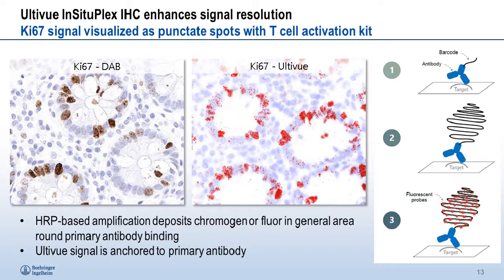And this threw me off at first, when we're looking at the Ki-67, because I wasn't used to seeing it as these punctate spots. But we go from a weaker Ki-67, which is more of a dispersed set of spots, to a higher concentration of spots in a local area, higher density, as a more intense staining in some of these nuclei. And this makes sense when we think about the platform itself and the technology behind it.